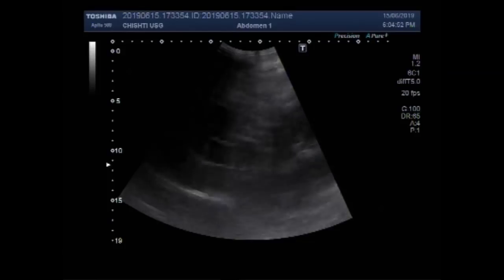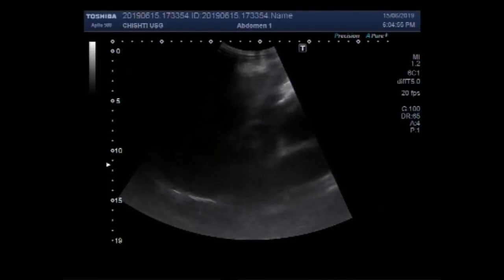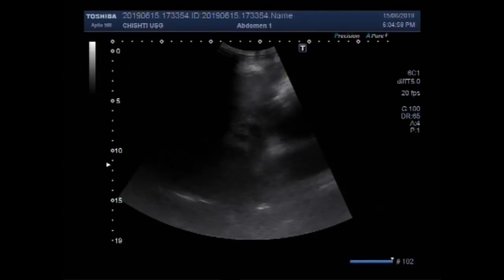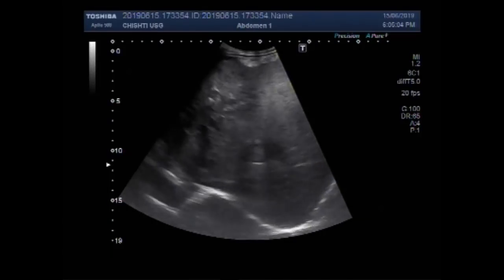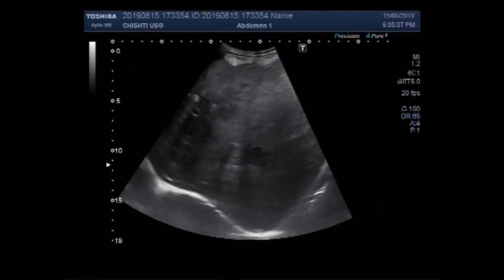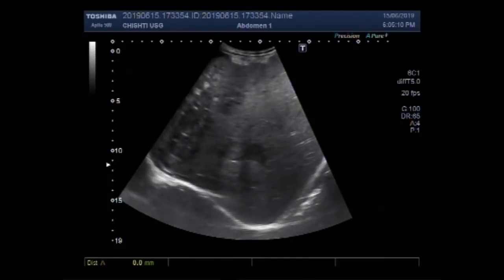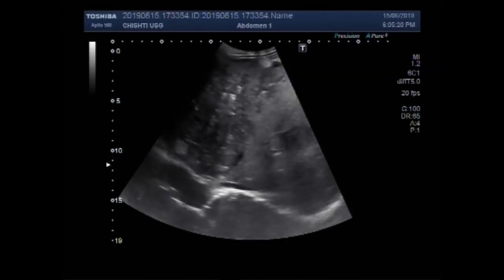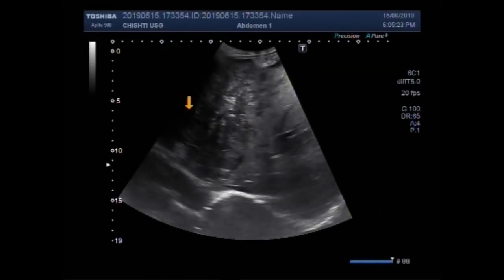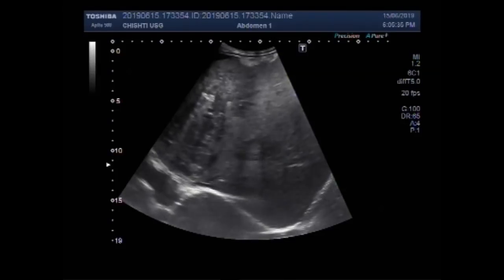The liver has coarse echotexture and a large mass is seen in the left lobe of the liver. This is the hepatic mass, having heterogeneous echodensity.